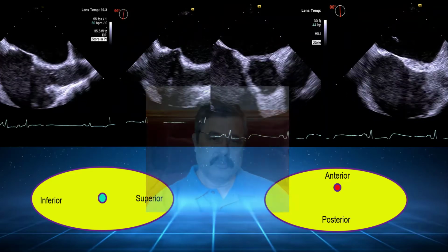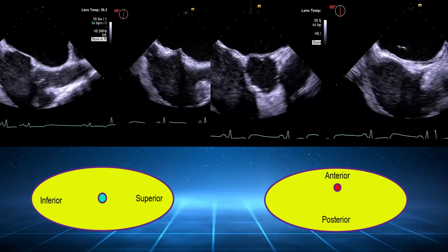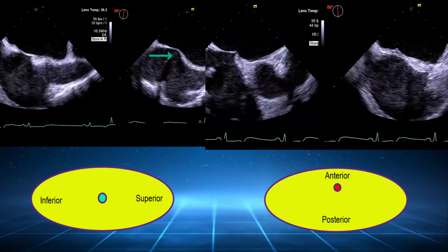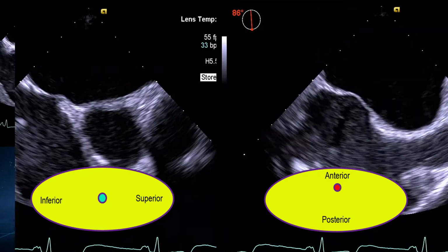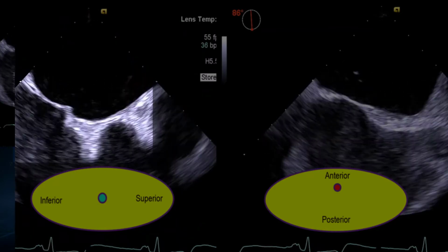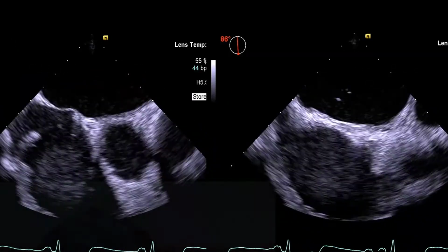As mentioned earlier, due to the elliptical shape of the fossa ovalis, our first attempt at septal crossing led to an indentation being produced at an optimal location in the superior-inferior axis. However, the indentation is more anterior than posterior, making it an unsuitable site for septal puncture to have an optimal trajectory of the device into the left atrium for a precise deployment of the mitral clip.